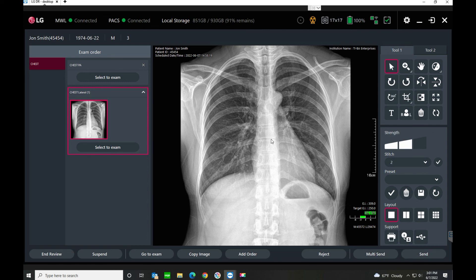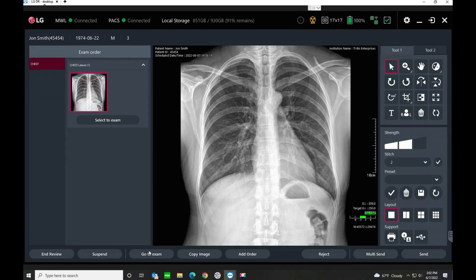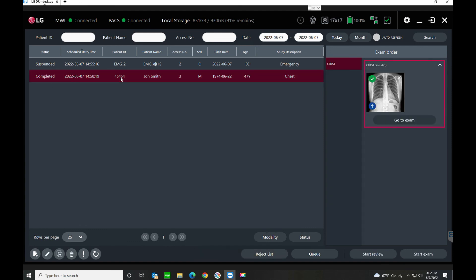Once we've got our image, we're happy with it, we've QC'd it, and we decide we don't need to take the second image, we can just End Review. Once we end review, we go to the worklist and now we've got a couple of different indicators to let us know how successful we were. The green check mark means the study is complete, and the blue arrow means the image was sent to PACS — at that point you're finished with your exam.